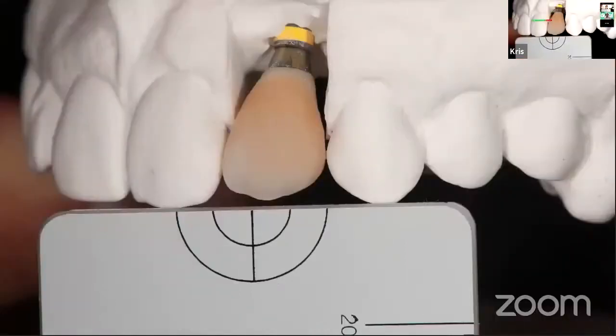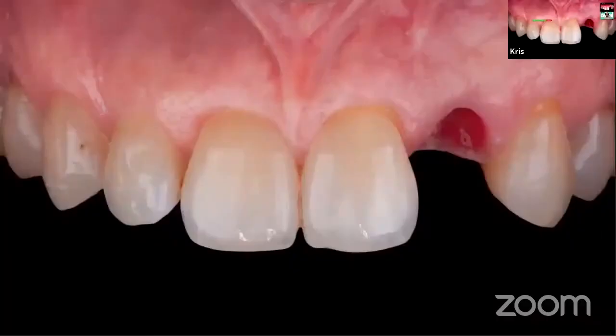Of course, everything is related to the type of solutions which we want to deliver, but the goal at the end is just to make a digital try-in, which a dental technician does during the process of building the crown. It helps a lot to finish the case and deliver it with perfect results. Of course, the color is one story, and the fitting is another story. Texture, this is high class at the end of the skills.